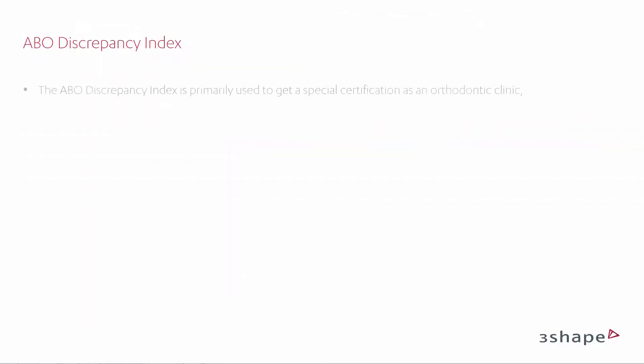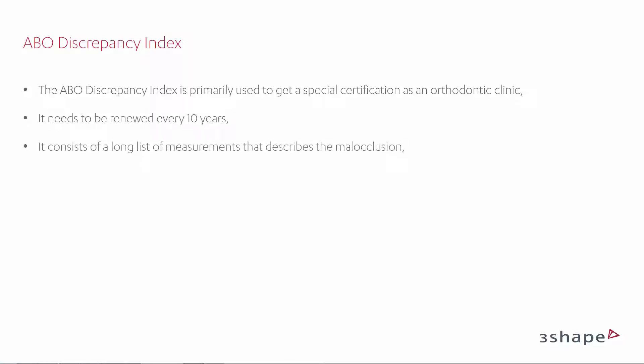The ABO Discrepancy Index is primarily used to get a special certification as an orthodontic clinic. It needs to be renewed every 10 years. It consists of a long list of measurements that describe the malocclusion.